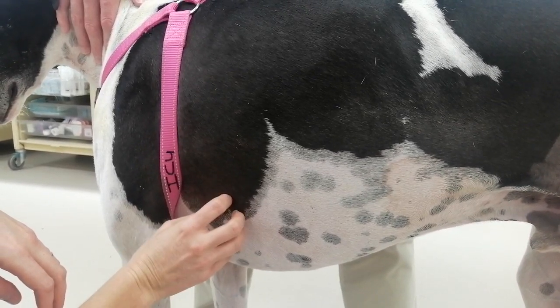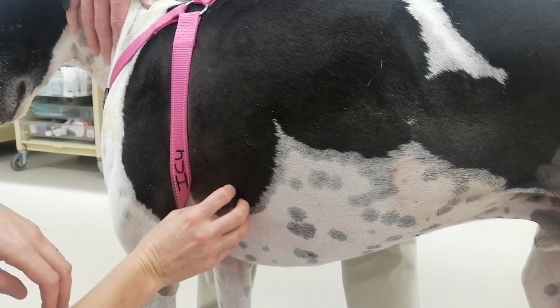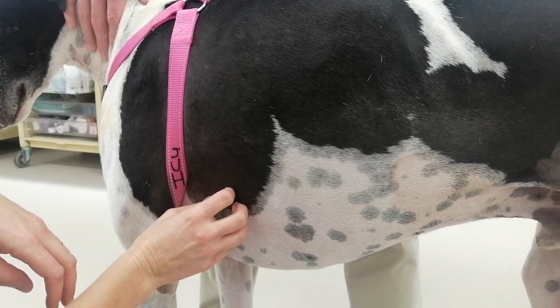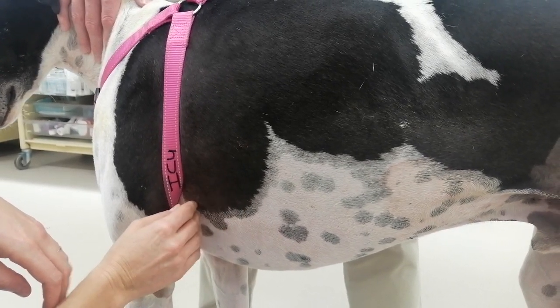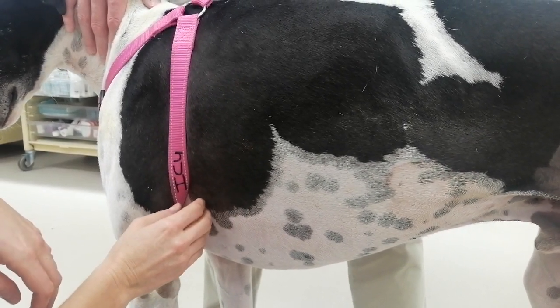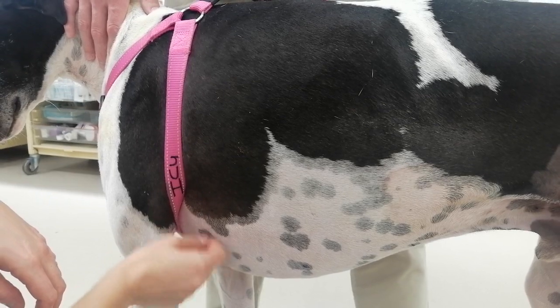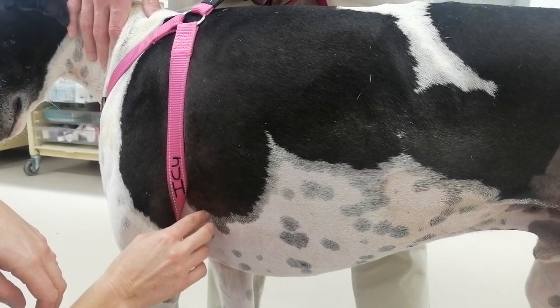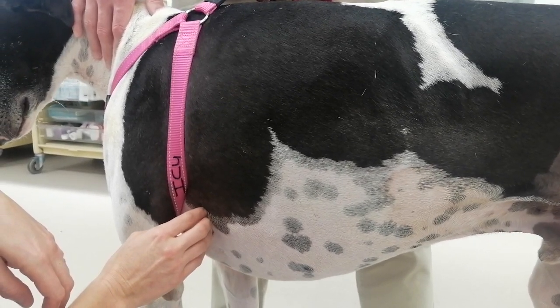After evaluating at the point of maximum intensity, you can go to the aortic valve, which is at the fourth intercostal space. This is slightly above the costochondral junction where you would evaluate the aortic valve.